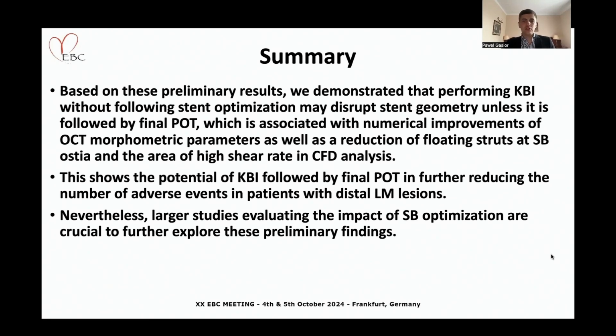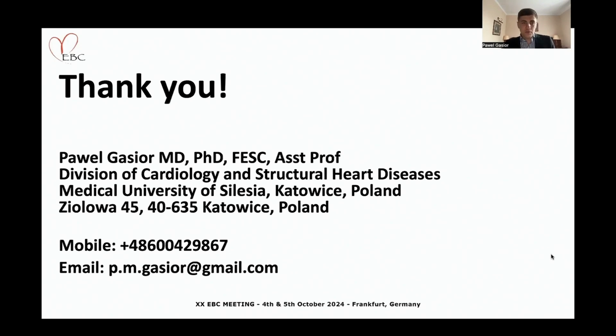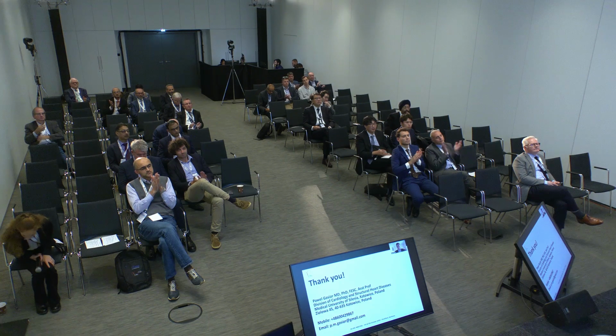This shows the potential of kissing balloon inflation followed by final POT in further reduction of the number of adverse events in patients with distal left main stenosis. Nevertheless, larger studies evaluating the impact of side branch optimization are crucial to further explore these preliminary findings. Thank you very much again, and if you have any questions, I am open for discussion. Thank you.